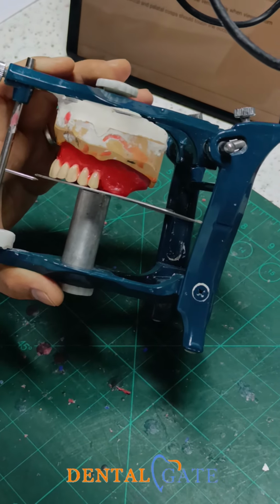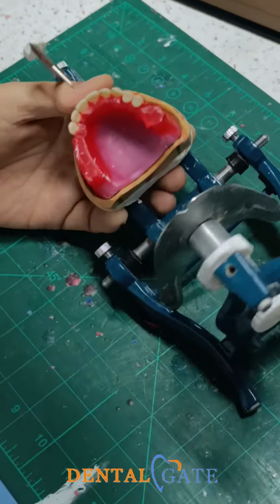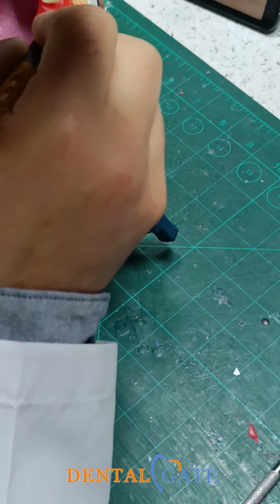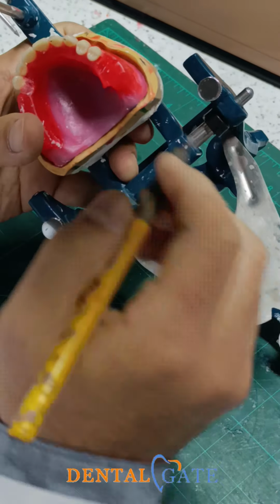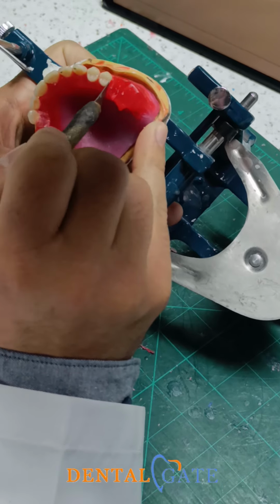What's the criteria of the upper six, the first molar? What's the criteria of the first molar? This is the cornerstone of the posterior teeth.